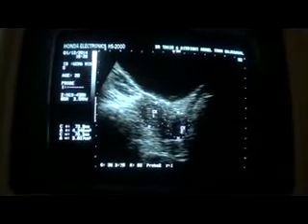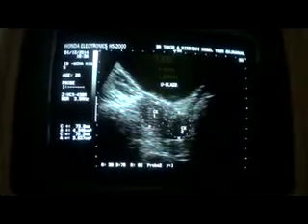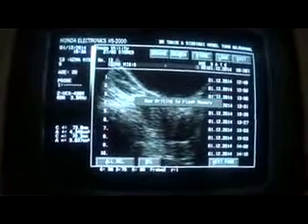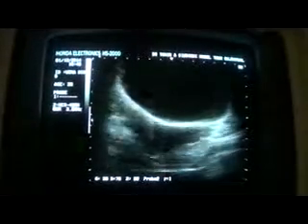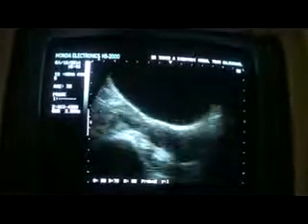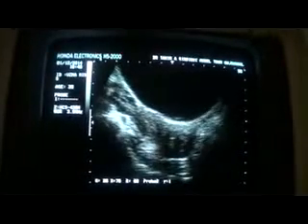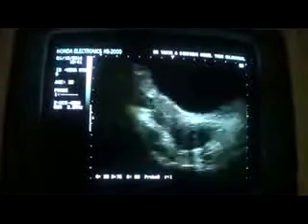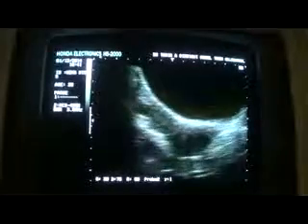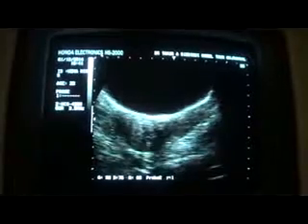So this is the urinary bladder. In fact, we are now studying uterine didelphys, with 2 cervixes that I have shown you. This is uterus number 1, and this is uterus number 2. Both have their own cervixes.